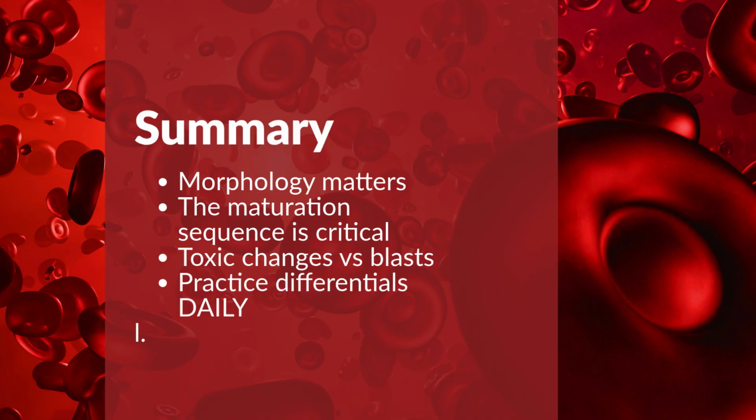Remember, myeloblast, promyelocyte, myelocyte, metamyelocyte, band, neutrophil.